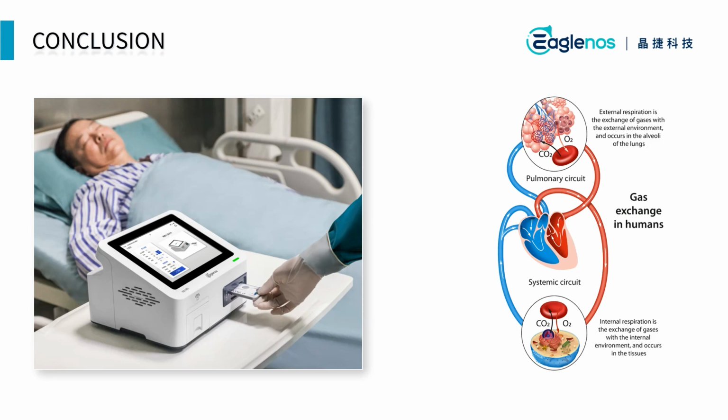Through blood gas analysis, clinicians can quickly assess a patient's oxygen delivery, acid-base status, and electrolyte balance, allowing for timely and effective treatment decisions. We also explored how key parameters such as lactate and central venous oxygen saturation help assess a patient's hemodynamic status and tissue oxygenation.